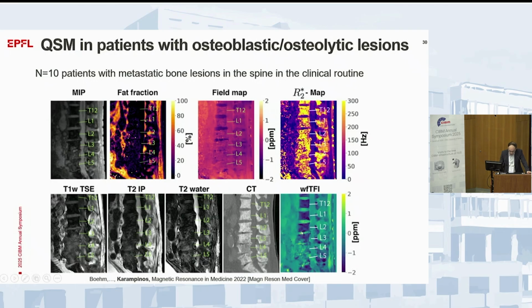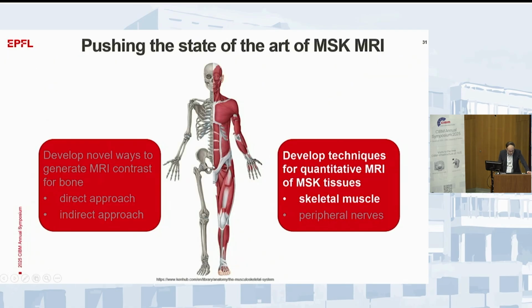I want to point out here, on this water-fat map, the susceptibility map, which is really able to show the very negative values of chi. These are unusually low, which relates essentially to the presence of the osteoblastic changes inside the vertebral locations, and also the changes we have in localized areas here. So QSM can be used not only in the brain, but in many applications, like for instance the search of calcified tissues. It is very useful also in other body parts, and of course, musculoskeletal imaging is one area of it.